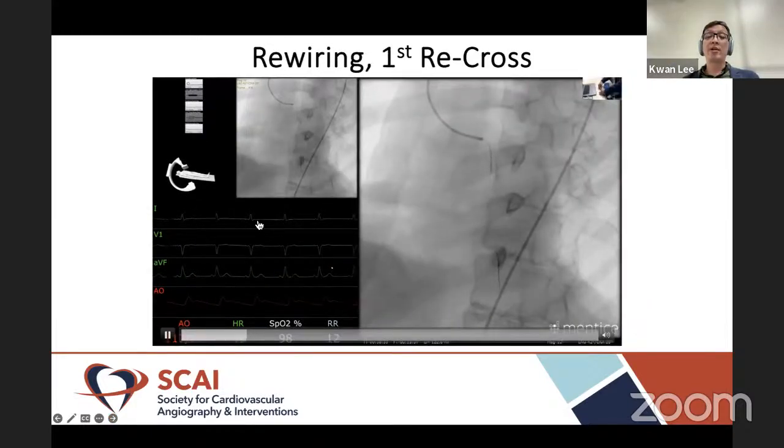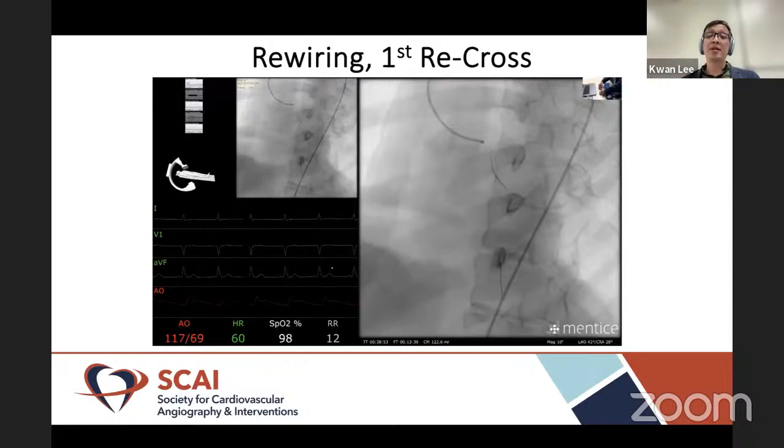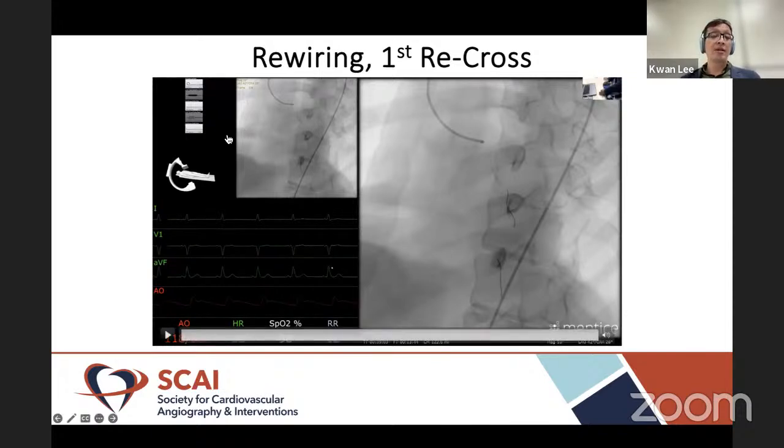And then we are rewiring. And you've seen that we've gone past the stent pullback. Just to remind everyone for DK crush technique, the crossing point is different than the other techniques. Right. The preferred crossing point for DK crush is proximal for optimal results.